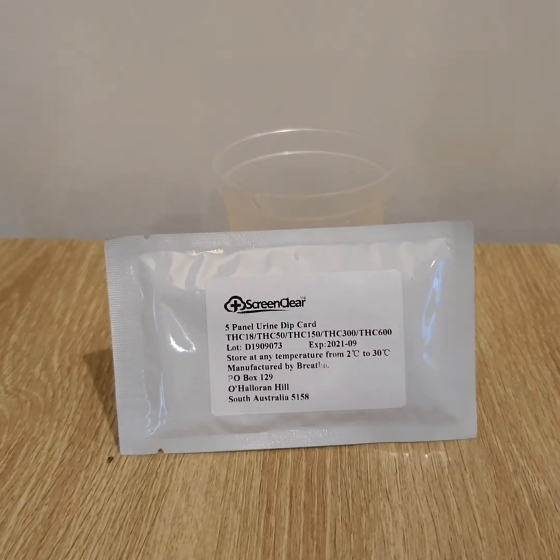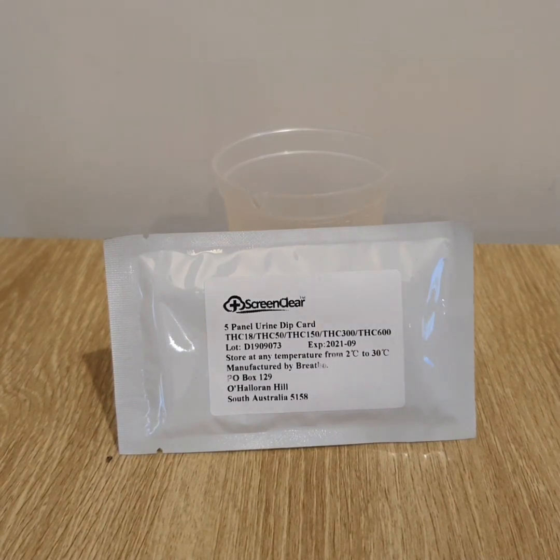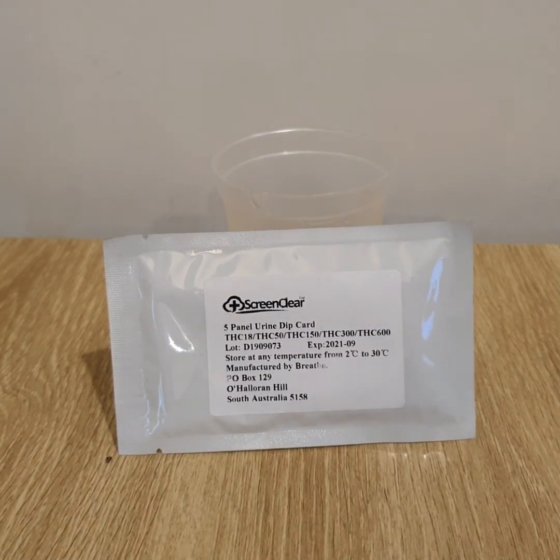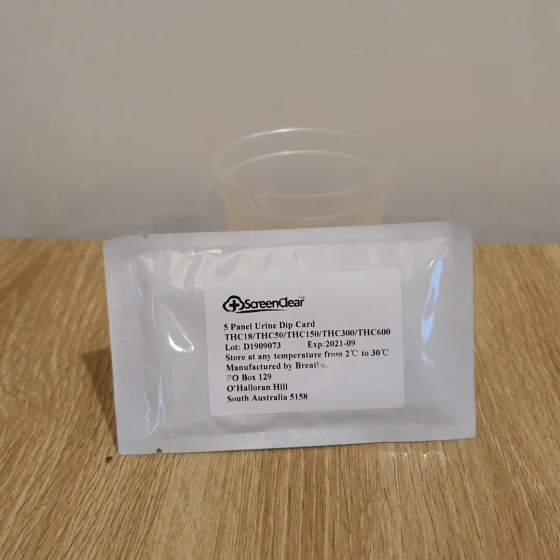Hi everyone, Dave here from Ausdrug Test with what we would call a revolutionary test for cannabis. What's good about this urine test is that you don't just get a negative or non-negative result to THC in urine — it will give you an indication of the amount of THC in a urine sample by testing five different cutoff levels in one test.